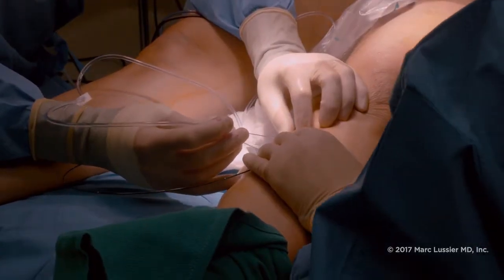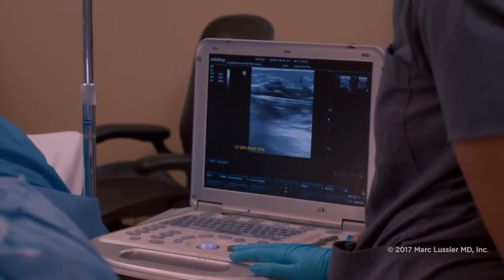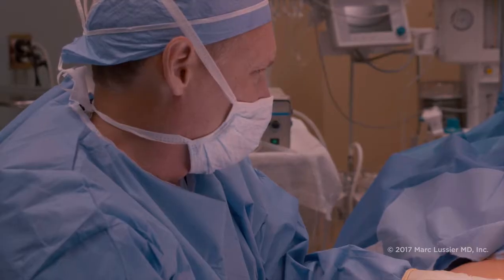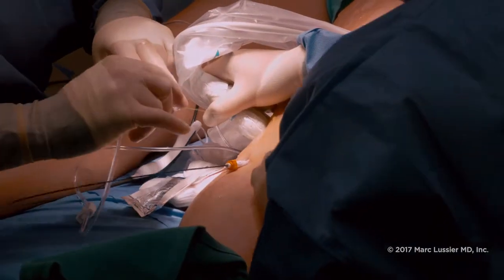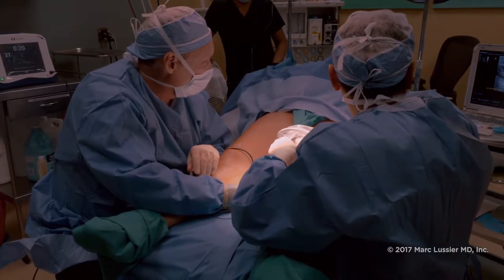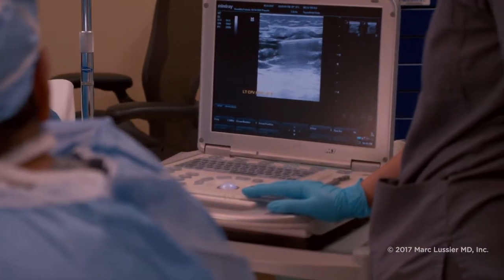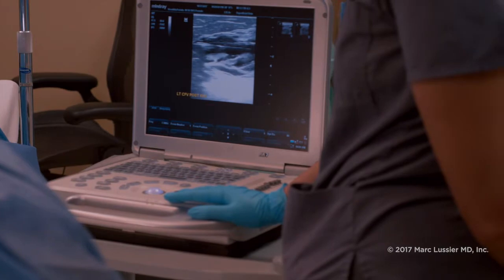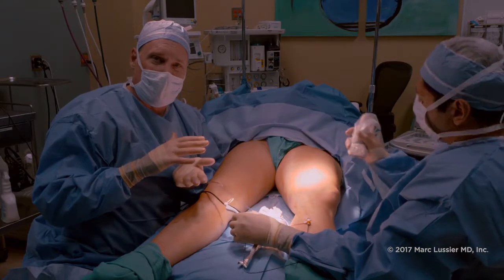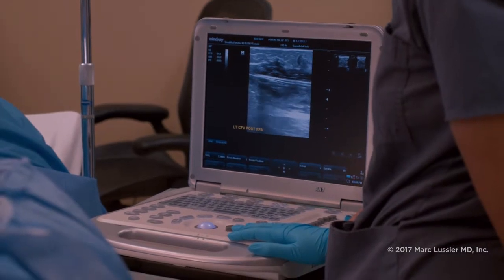I'm going to numb up at the site where we introduced the catheter — there's a layer around the vein and I can get inside that sheath and start injecting. What we just finished is numbing up the vessel, which serves a couple of purposes. We're using heat to collapse the vessel, so the medicine we injected numbs the nerves so there's no perception of pain. Importantly, it also stretches out the tissues so that when the heat disperses it doesn't damage the skin — otherwise you can have some untoward effects.